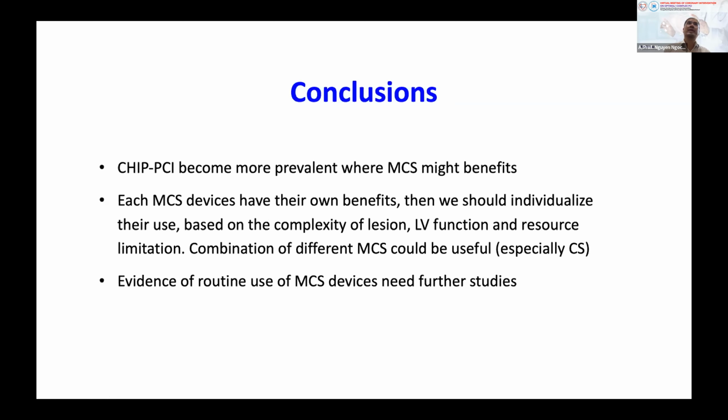Sometime in the future, we can combine a few devices together. I think it's really good, especially in patients with cardiogenic shock, but cost is really a problem in Vietnam. And so far, we don't have enough evidence to suggest routinely using the device in every case or every step. That's why we need to wait for a while.